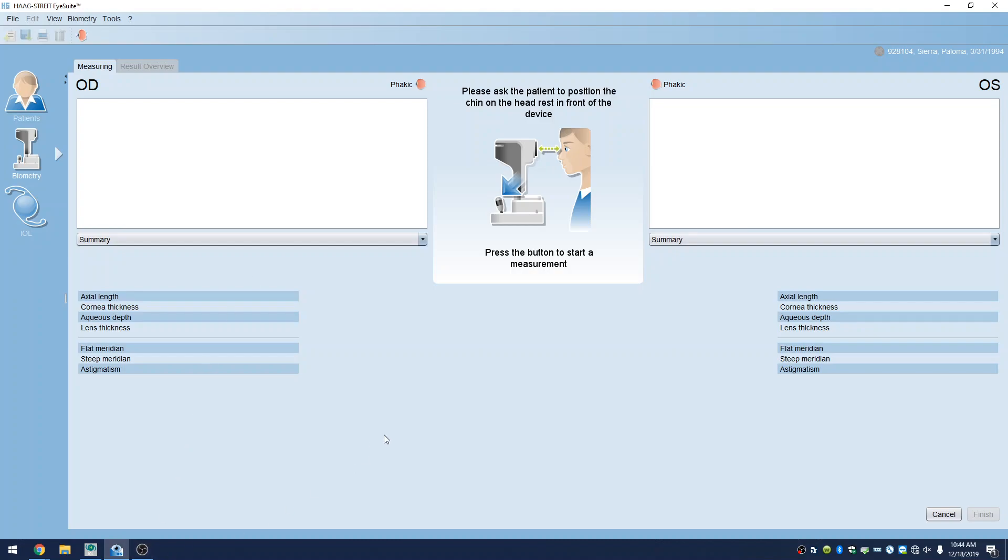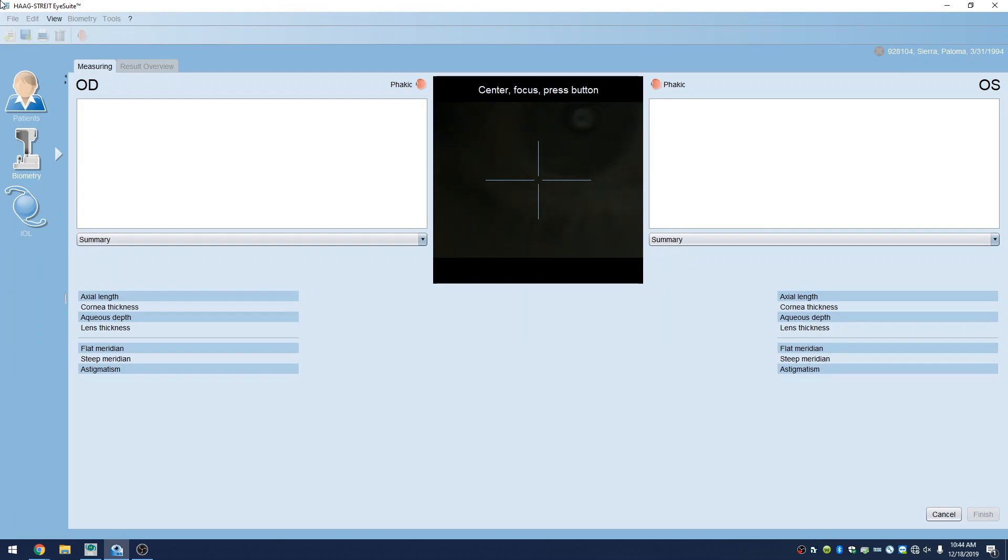And then I'll have you come forward, chin on the chin rest, forehead up against the band there. And then looking straight ahead, you'll see a blinking red light.